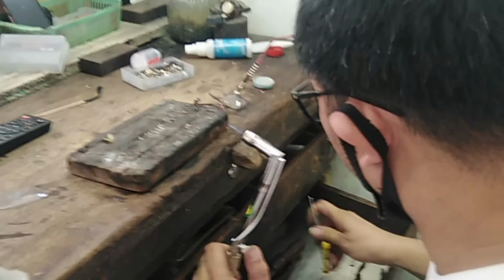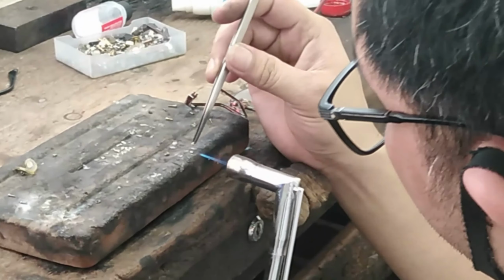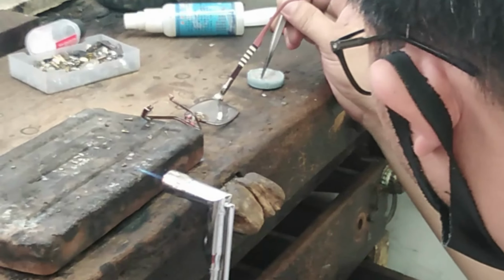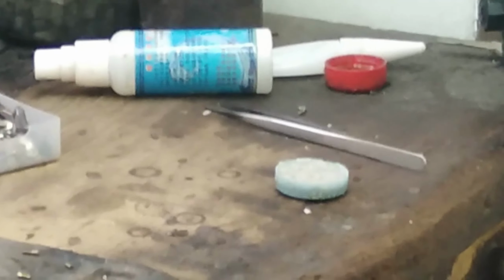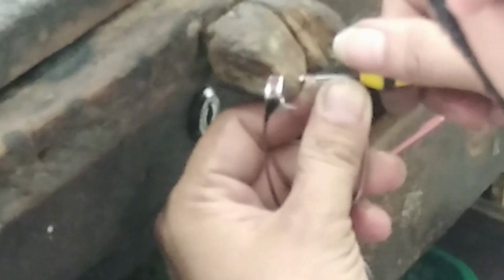Usually the problem with glasses is on the arm. So first, he will heat the other piece, having the lead, then combine it into the frame itself. As you can see, you need to burn it well to be able to combine the broken pieces. After that, you need to dip it in water to cool down. So now you will screw and fix the glasses.